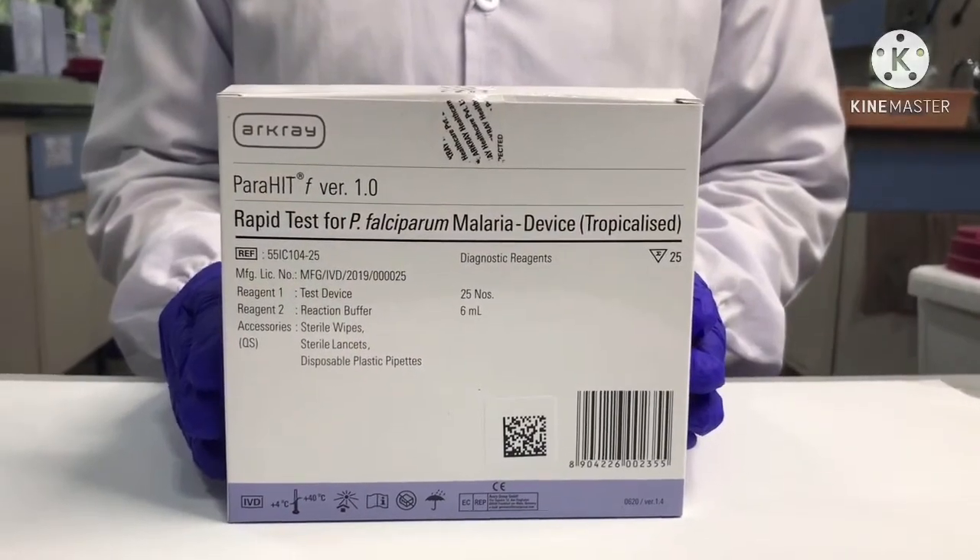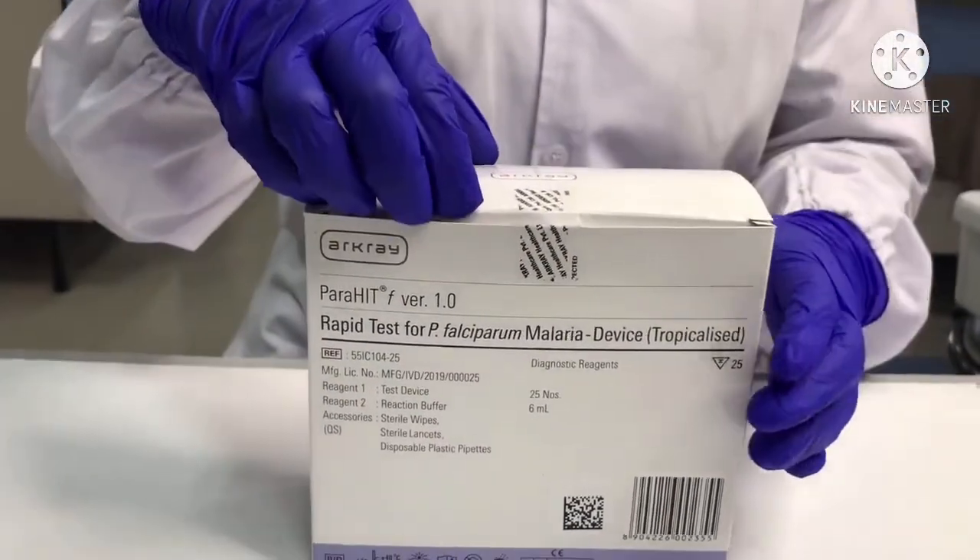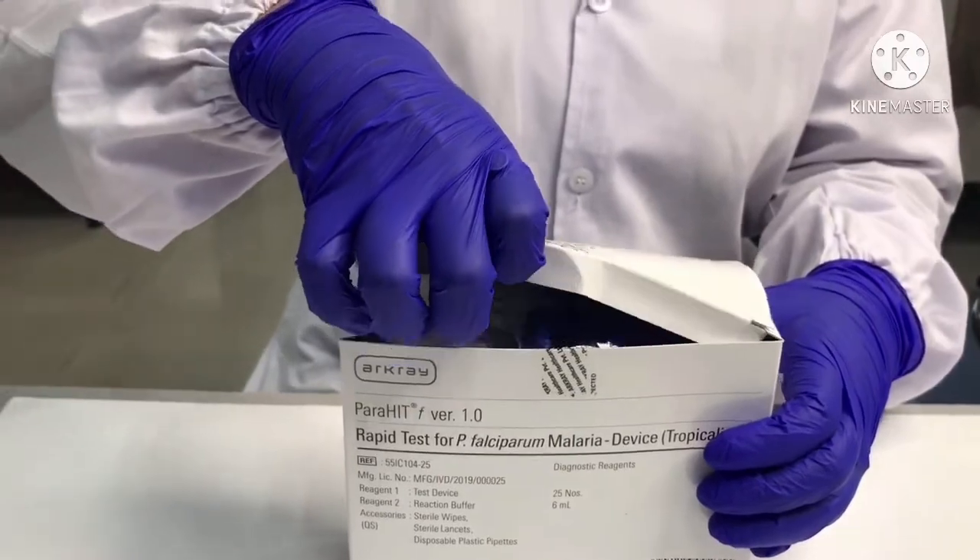Parahit F is a rapid lateral flow test from Arkray Healthcare for detection of P. falciparum antigen.